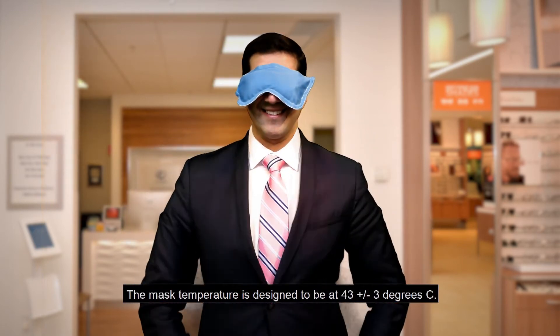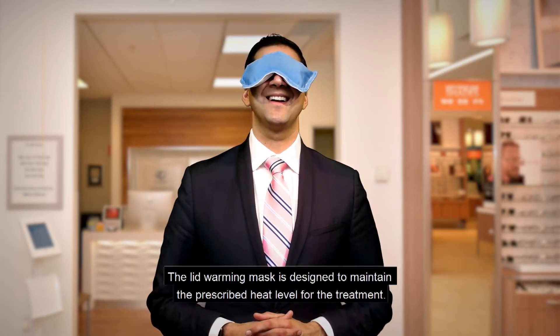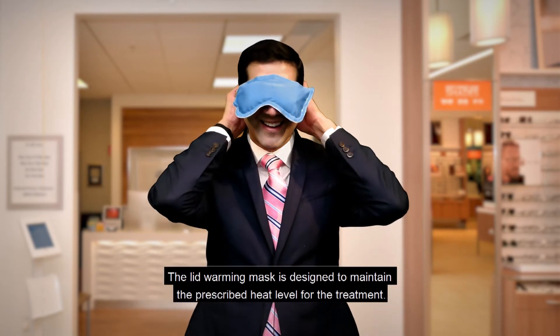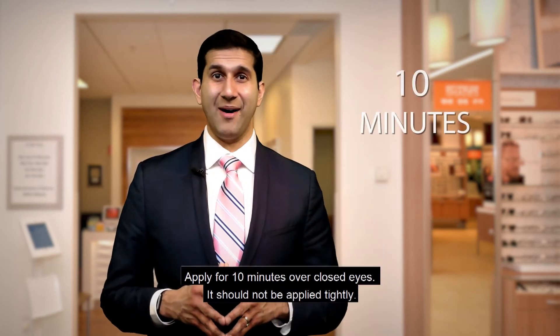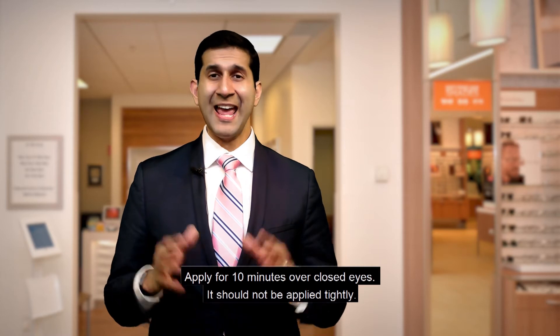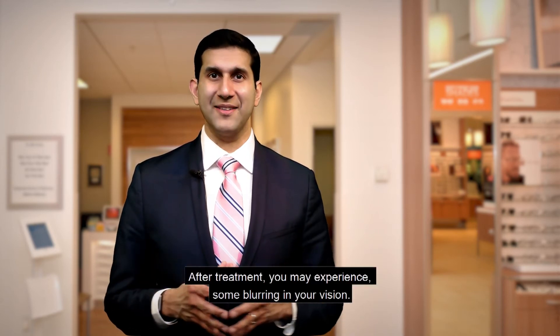The mask temperature is designed to be at 43 degrees Celsius, and is designed to maintain this prescribed heat level throughout the treatment. We advise you to apply the mask for 10 minutes over closed eyes. It should not be applied too tightly. After 10 minutes, remove the mask.